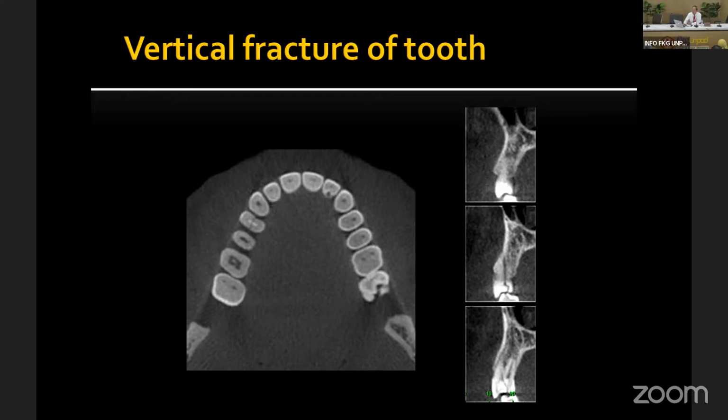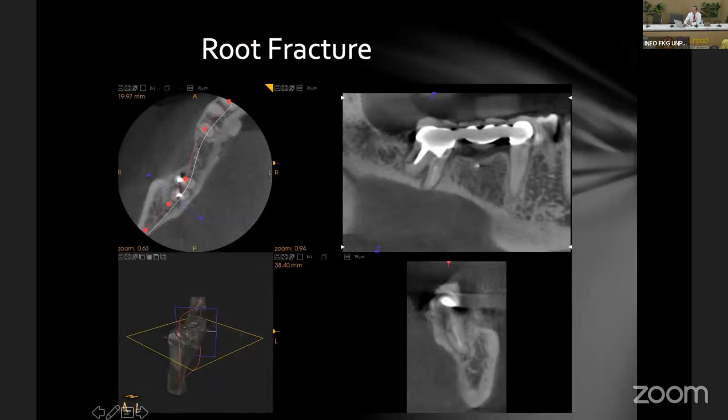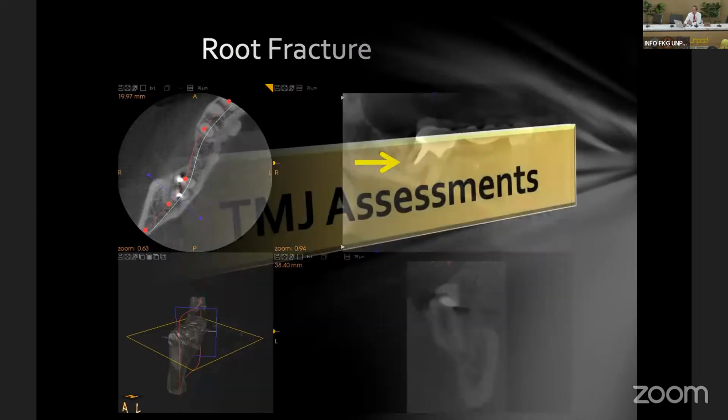But with the cone beam, you can easily see that the fracture is here, and this is a mesial-distal root fracture here. Also, root fractures tend to be in the area of the post and core. That's the area where you often see the root fracture.